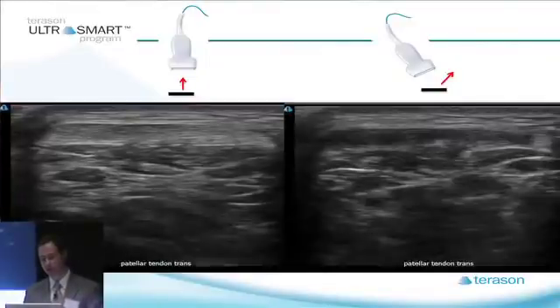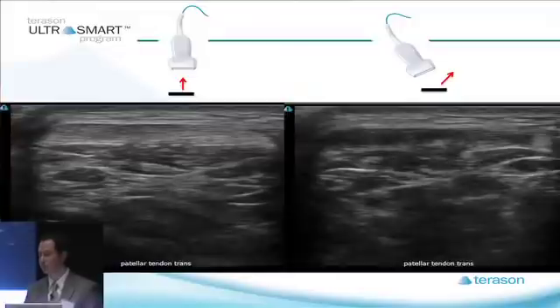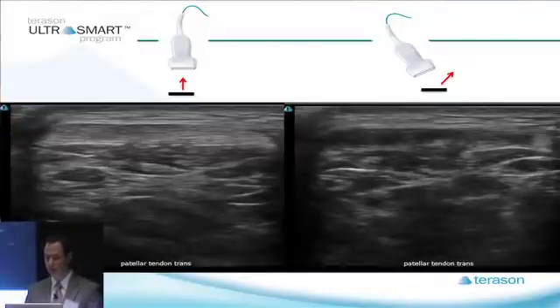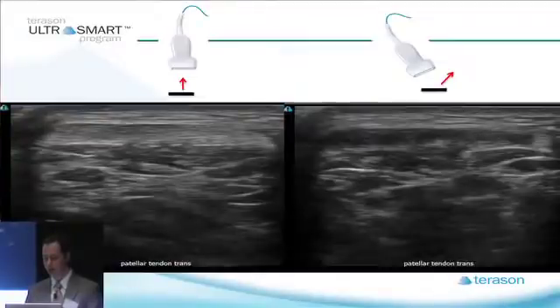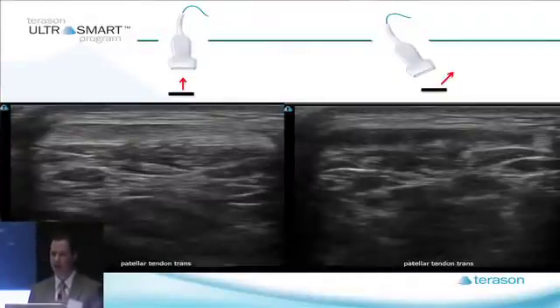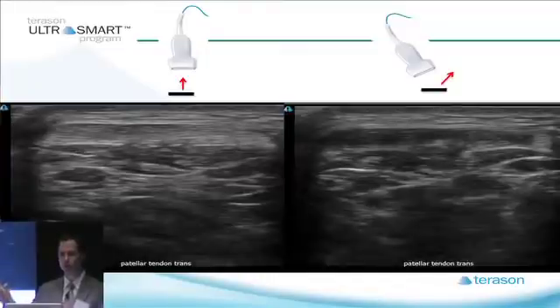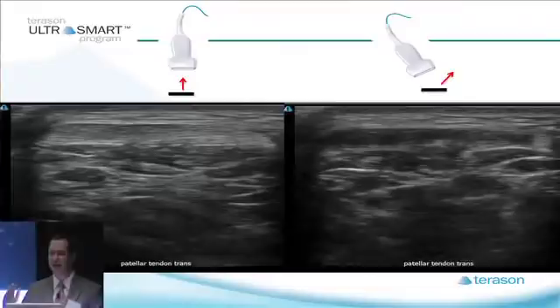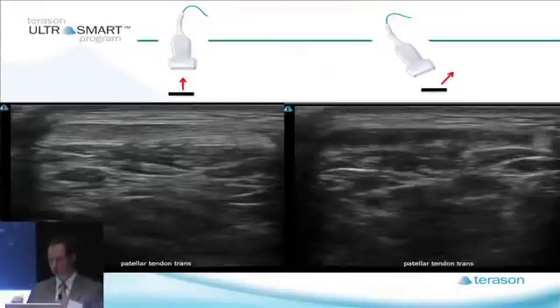Or you can actually utilize it to your advantage and differentiate the patellar tendon from other structures around it. In this picture, you see the patellar tendon is relatively isoechoic to the surrounding structures, including the superficial tissue and the deep fat. But in this picture, it's relatively dark, so you really get a good sense of where it is. Toggling the transducer is part of what you're going to do to bring this effect in and out of your field of view.